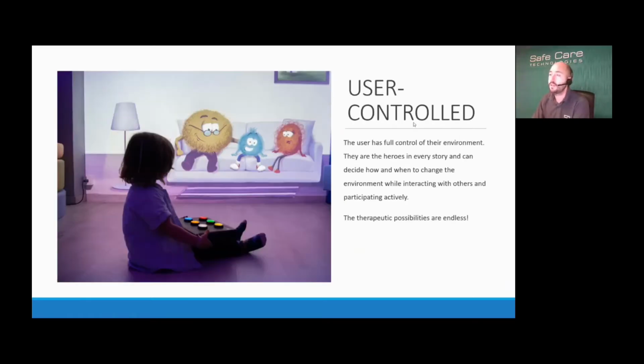You have the option of having it user controlled as well. Depending on the access methods that you choose, the user themselves can actually access the device. So you could have a tablet, maybe, for the therapist, but then the actual user may have the button 6, for example, or even the dice, which I'll talk about in more detail in a while. They can access the method and have more control themselves as well.